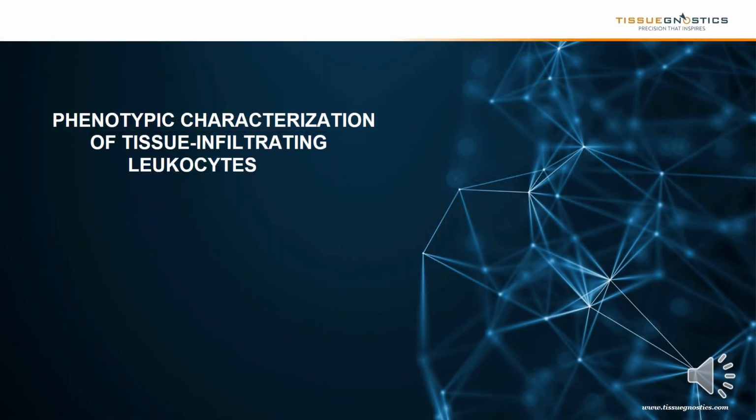Maybe one of the most important applications of TissueFAXS cytometry is the determination of the immune status in situ. With flow cytometry, we can determine the immune status systemically in blood. With TissueFAXS cytometry, we can determine it in a specific organ in a specific tissue. This is also called the phenotypic characterization of tissue infiltrating leukocytes.